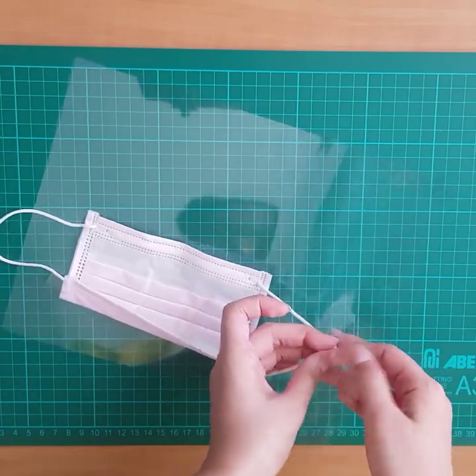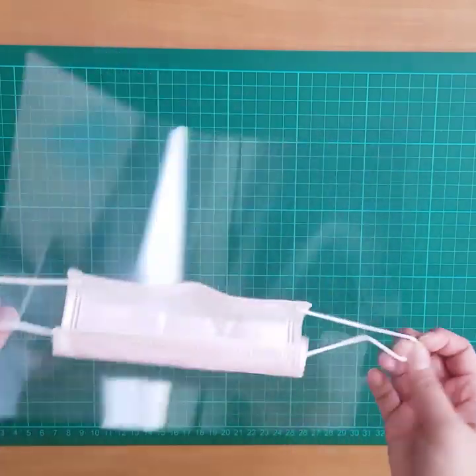outer side down. The mask is to be worn inside the plastic shield. Adjust it over your face and you're done.